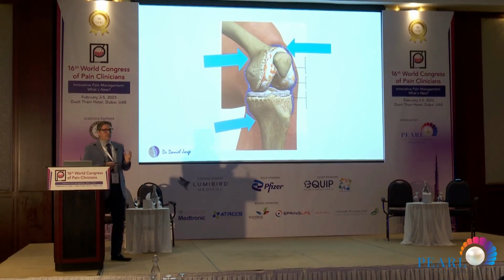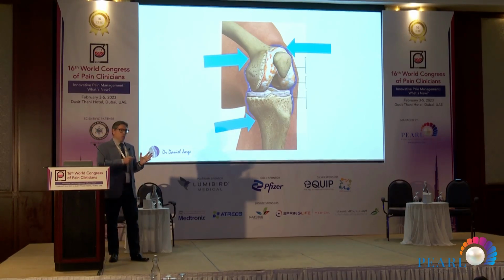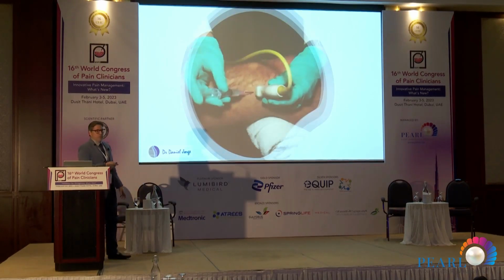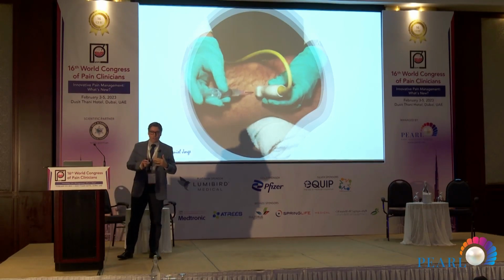For the genicular nerves, as we've seen yesterday, we can use the usual approaches for the medial superior, the lateral superior, and the medial inferior one. We are starting to use the ultrasound to do this kind of procedure, so you have to be concerned about your hands, how your needle is going to be and how your transducer.